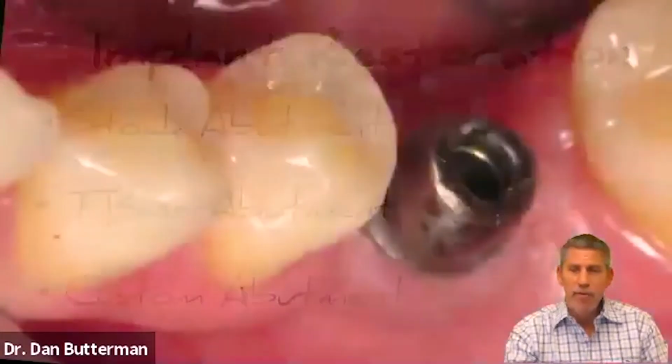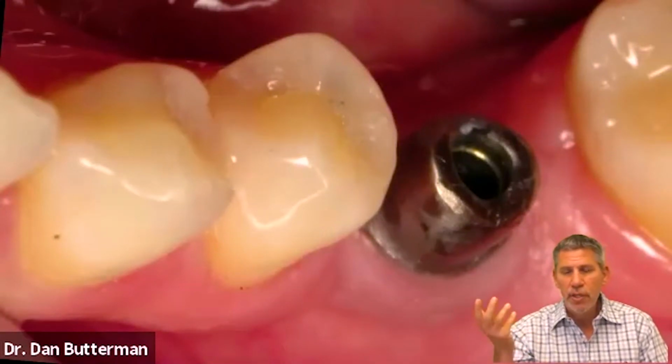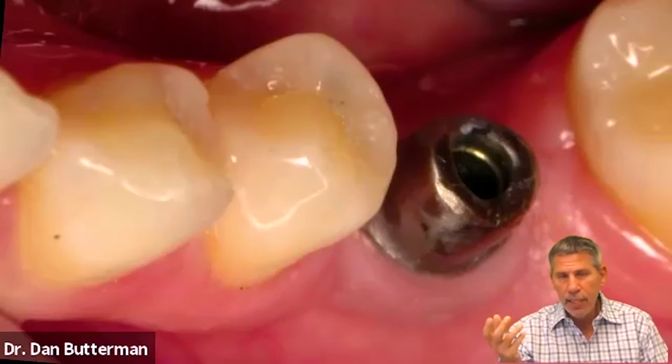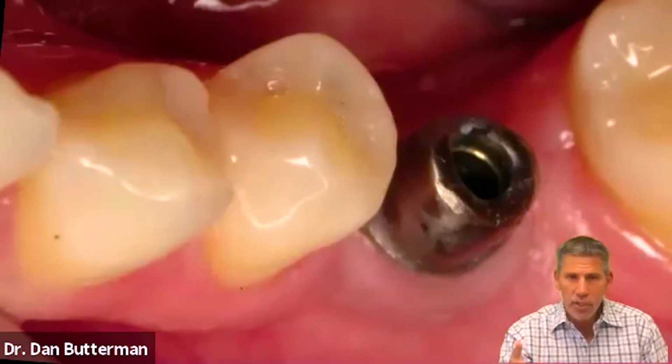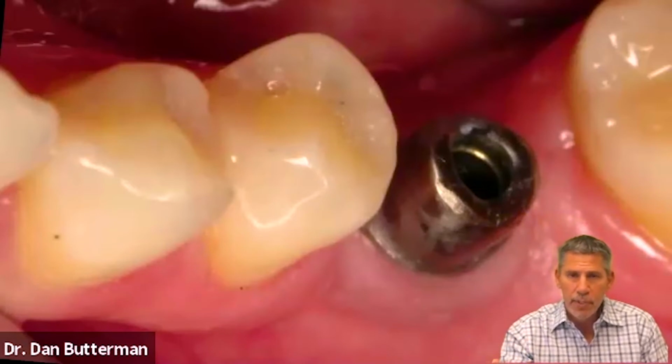Stock abutment, I have no use, quite honestly, for a stock abutment ever. And in my office, I just don't see an advantage. But you could. I mean, I can buy an abutment, I can prep it in the patient's mouth and adjust the margins and contours. And for those of you that have never prepped an abutment in the patient's mouth before, milling, hitting the stuff with a diamond, it's a little bit intimidating.